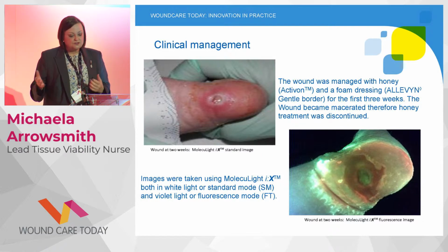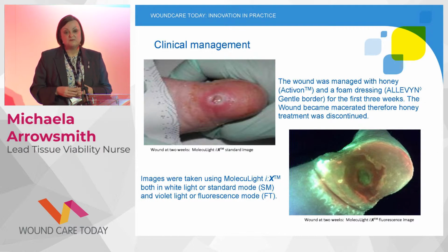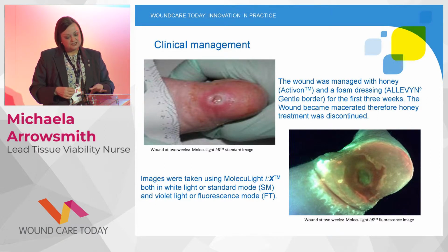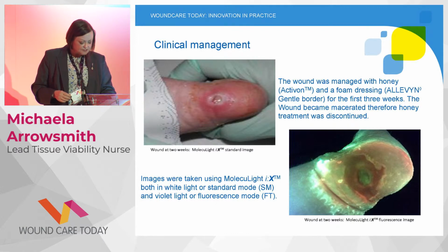So if you look at it visually, you would look at the wound on the left and say, well, it's not particularly infected, a bit macerated. But actually you can see from the Moleculight image that it's looking okay. There's no bright red glowing infection there. So that's after 2 weeks.